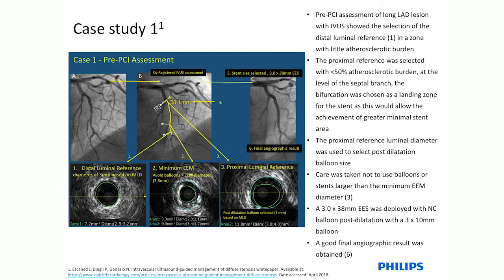Here we have some cases that basically illustrate this type of situation. So you have here the pre-PCI assessment of this long LAD stenosis, in which IVUS demonstrated that the distal part is pretty devoid of atherosclerosis.